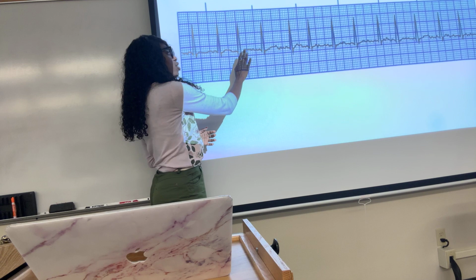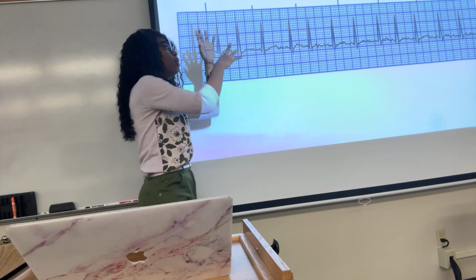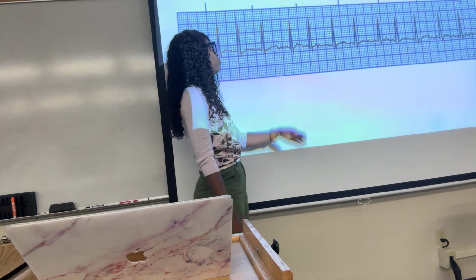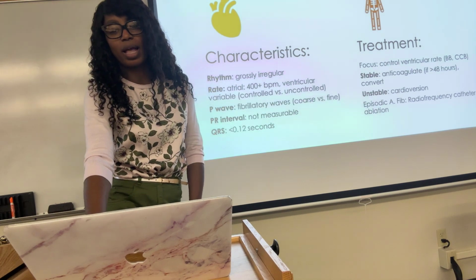It's long. There's a lot going on in here. But how do we differentiate the flutter and the fibrillation? The fibrillation is not calculated. It's just going up and down. It's doing this dancing motion. Like, I don't know. It's going crazy. But this is called atrial fibrillation. So atrial fibrillation, also known as AFib.